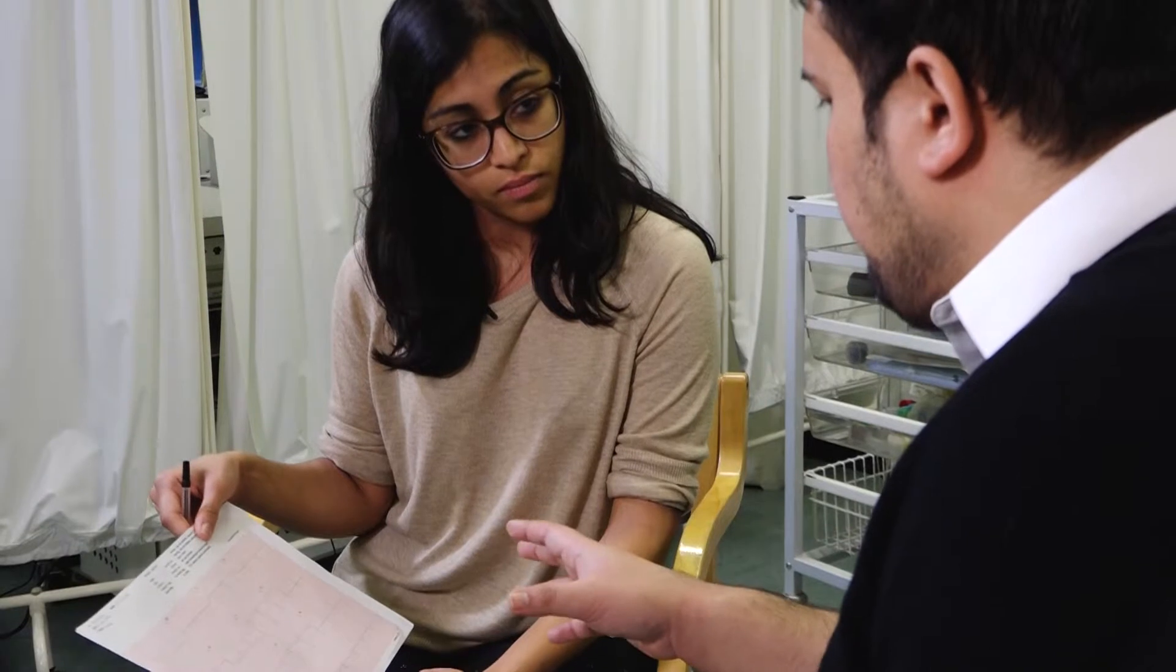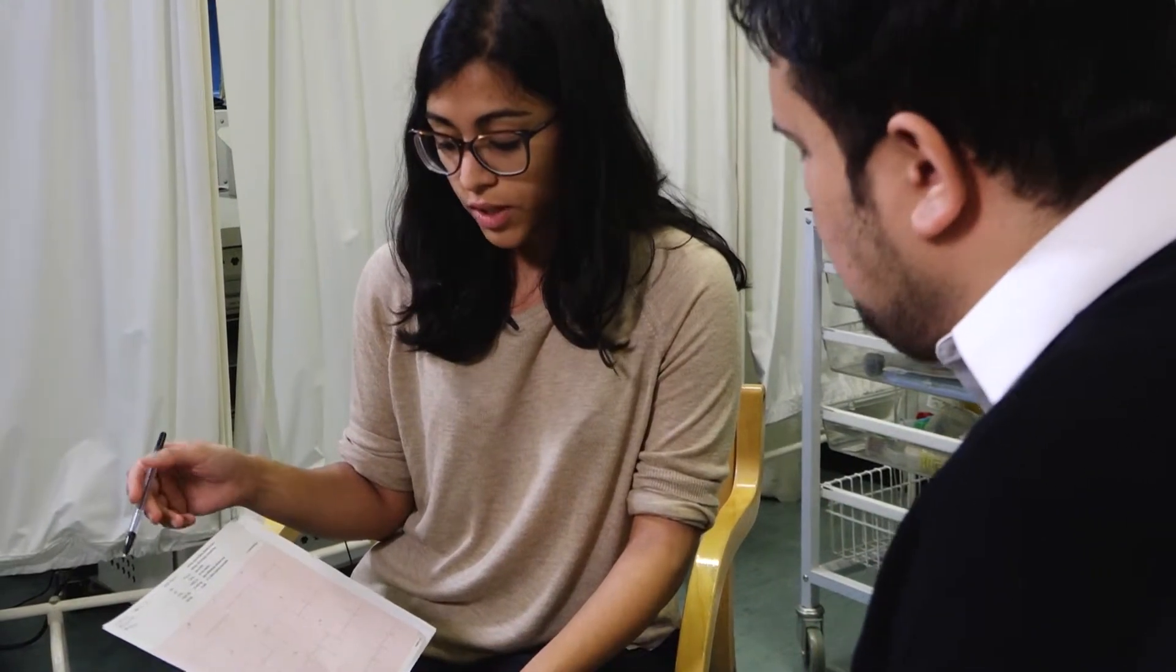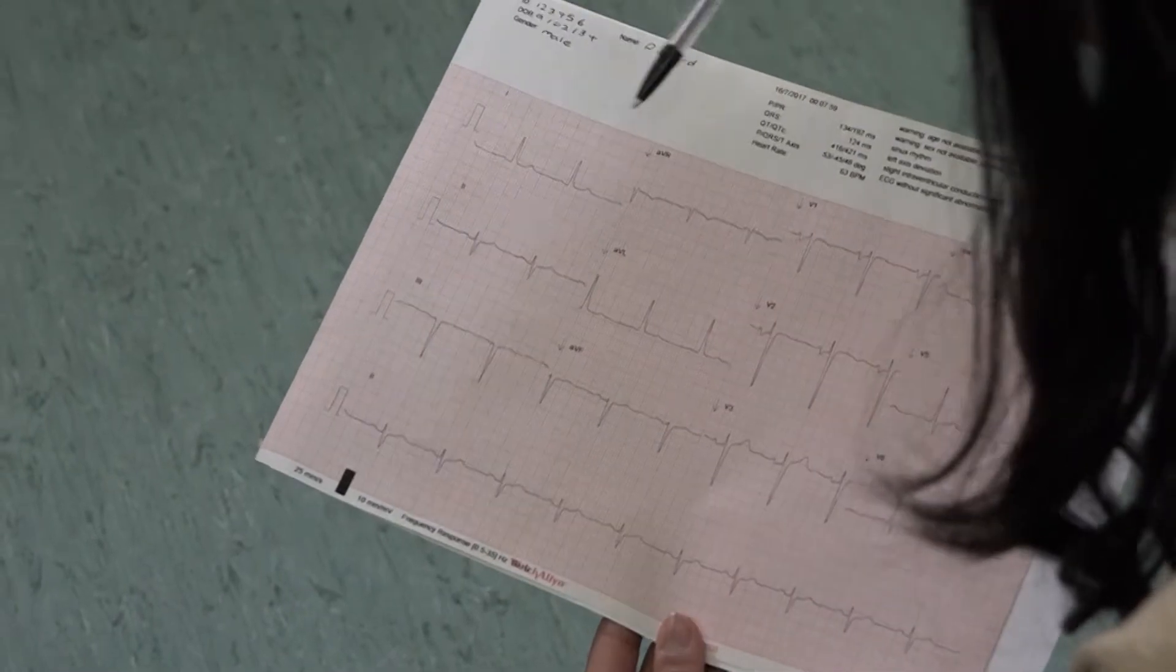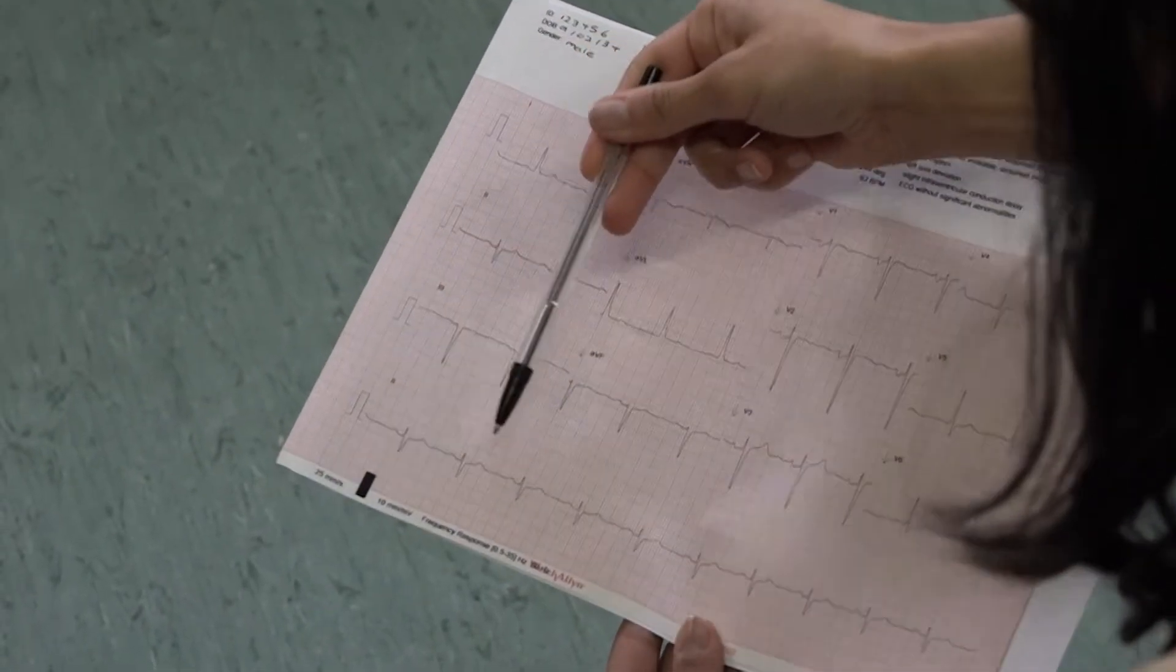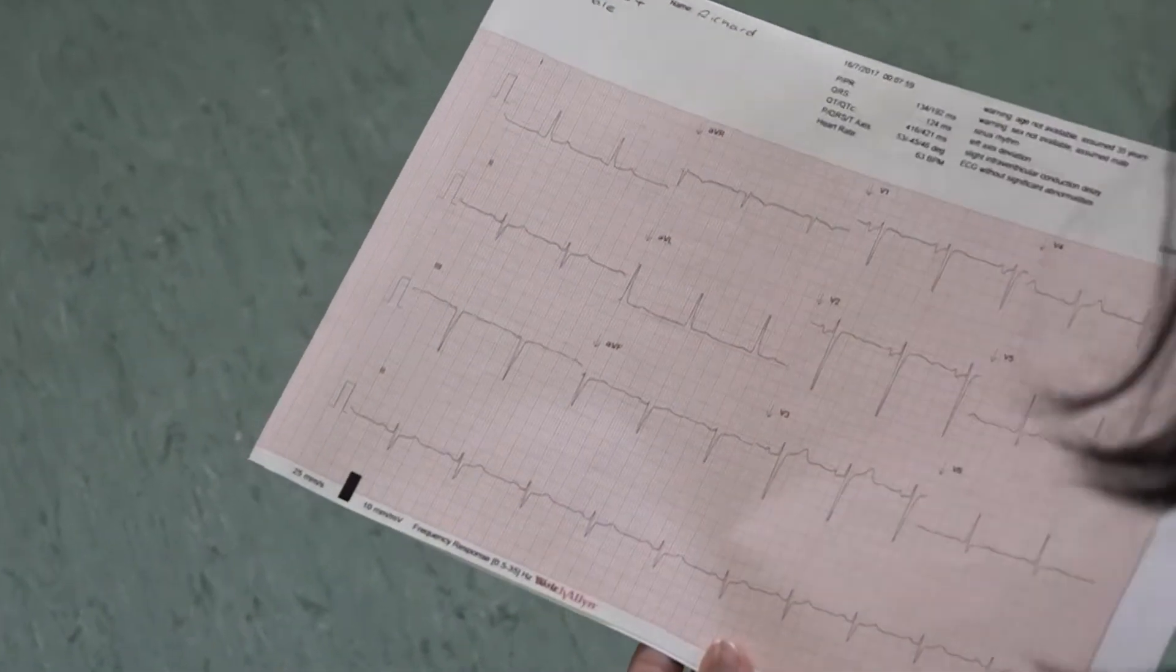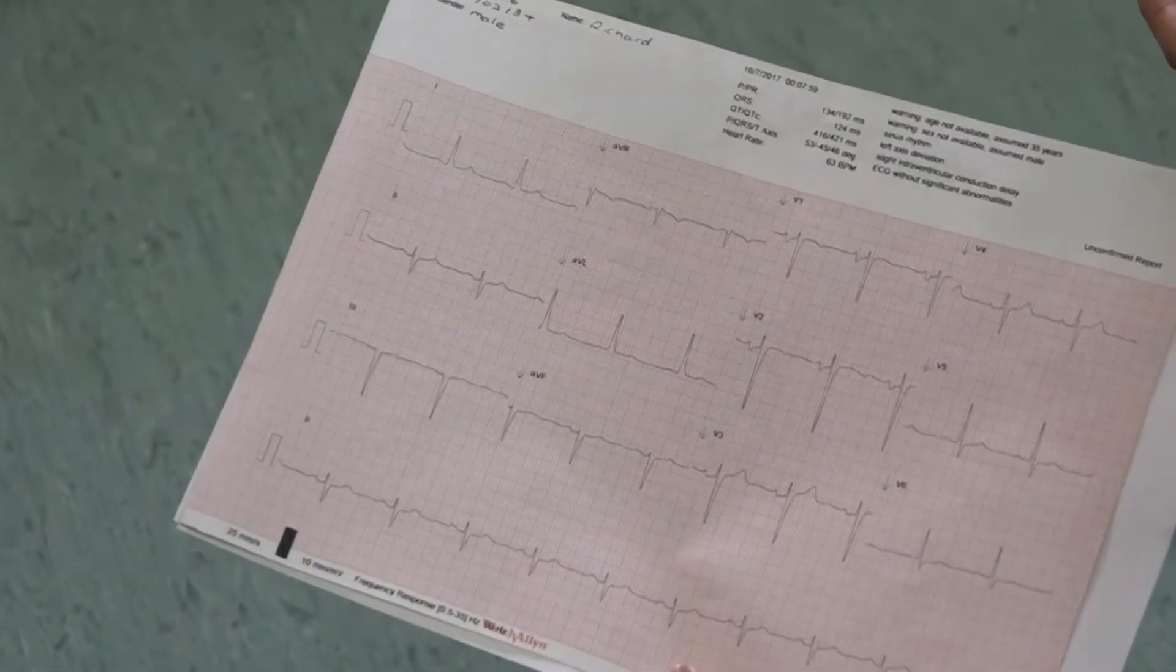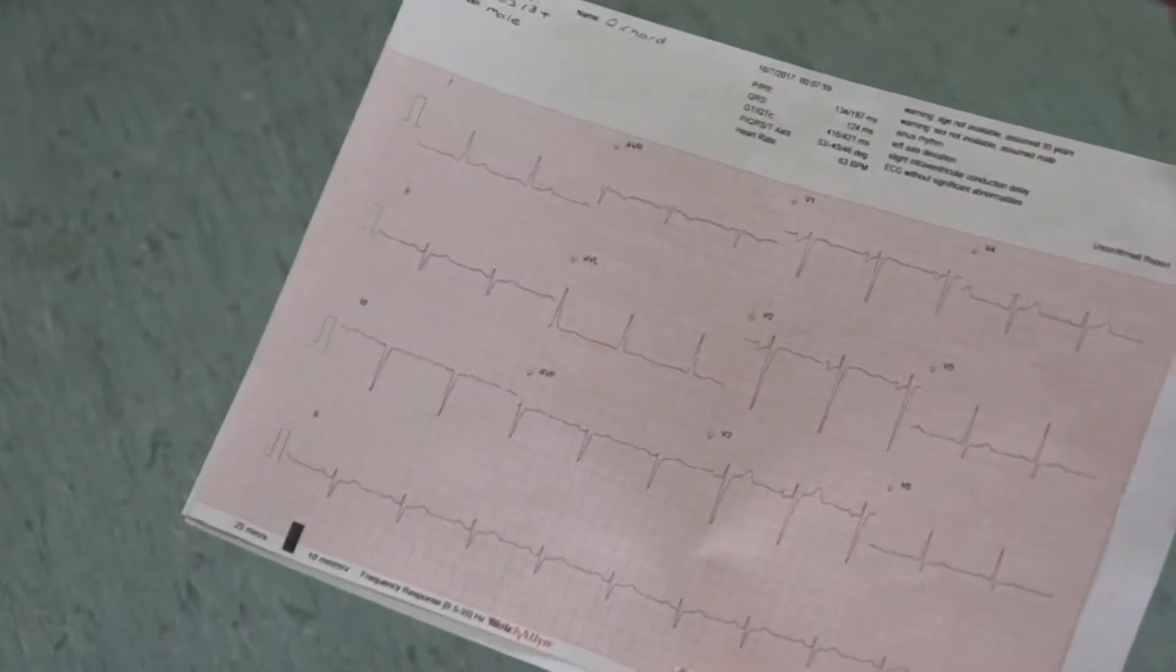Could you try and work through the components and the complexes for the ECG for me? Sure. The first wave in our ECG will be the P wave. You want to make sure that there's a P wave preceding each QRS complex. You can look at that with the rhythm strip. If there aren't P waves preceding each QRS complex, that suggests there is atrial fibrillation.